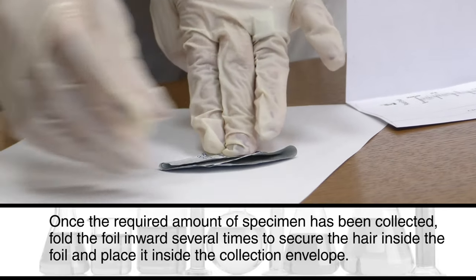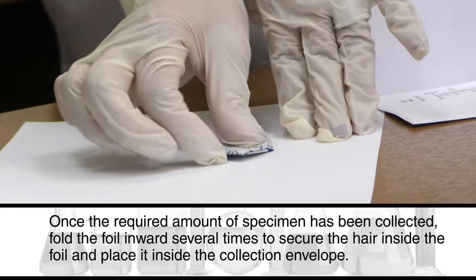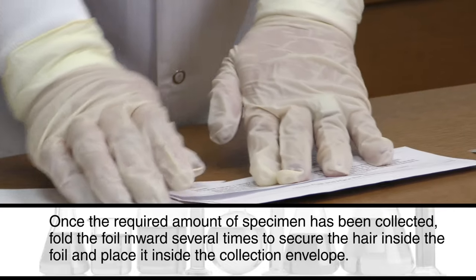Once the required amount of specimen has been collected, fold the foil inward several times to secure the hair inside the foil and place it inside the collection envelope.